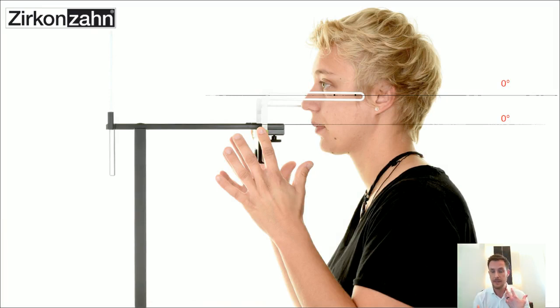This helps me understand, if the patient goes out of the plane finder and goes inside again, whether those dots are still straight or a little tilted, maybe because the head is tilted a little more down. That is the indication that the patient cannot reproduce the head position, so we have to check that.